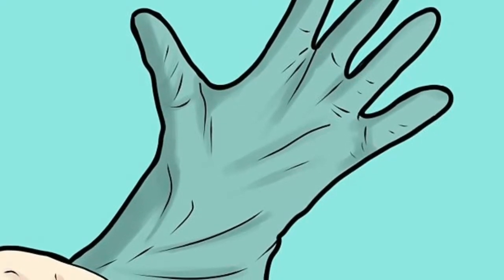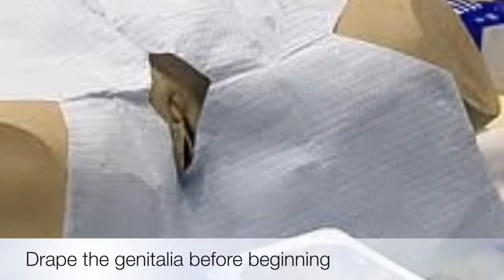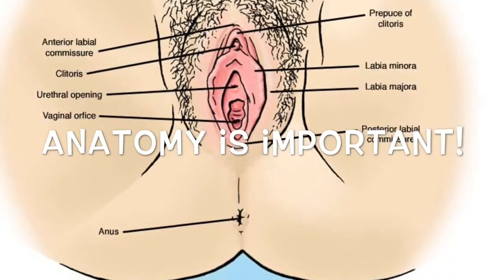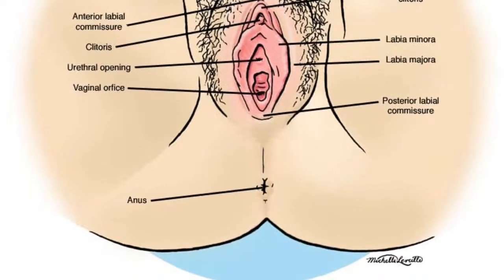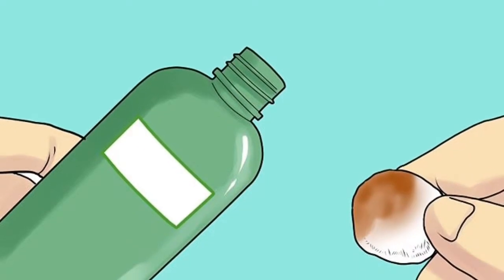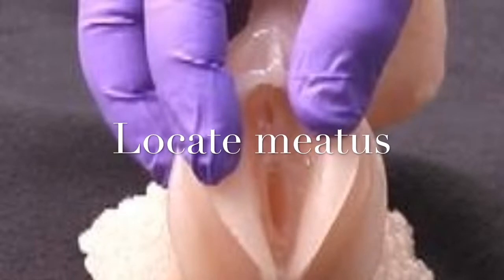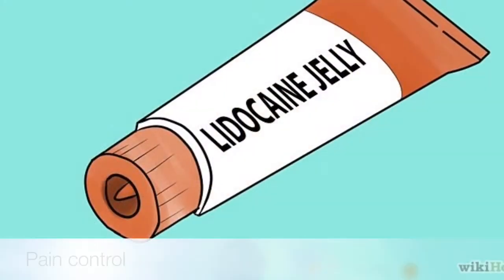Remember, these are sterile. Using your non-dominant hand, use lateral and outward traction on the labia in order to identify the urethral meatus. Cleanse the urethral meatus and surrounding area with antiseptic solution. Grasp one cotton ball with the forceps, wipe one side of the labia from top to bottom, and discard the cotton ball away from the sterile field. Repeat on the opposite side and in the middle using the third cotton ball. Then wipe the area dry with the dry cotton balls.